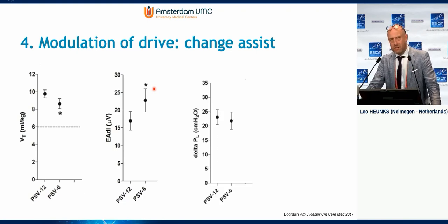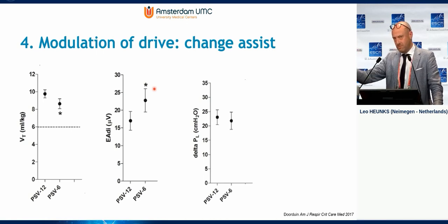And therefore, the transpulmonary pressures remain more or less the same. So you think reducing pressure support is good, but at least in this study we found there was not much change in the transpulmonary, in the damaging pressures applied to the lung.